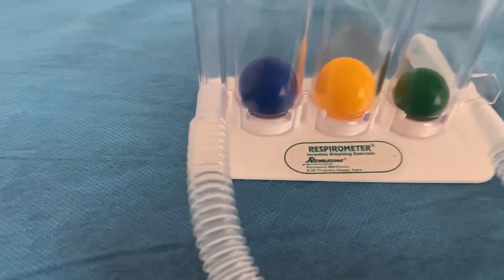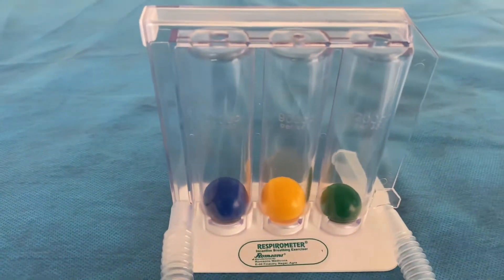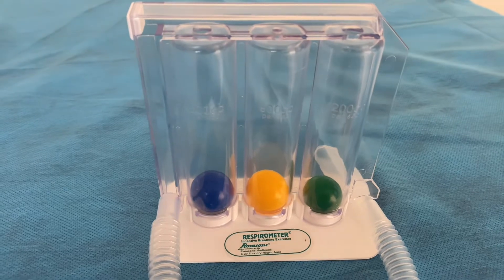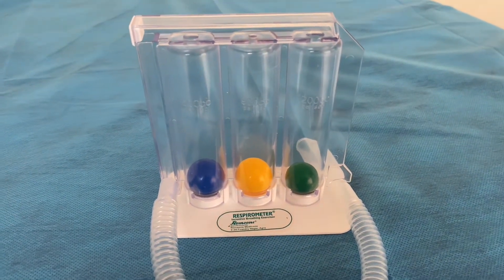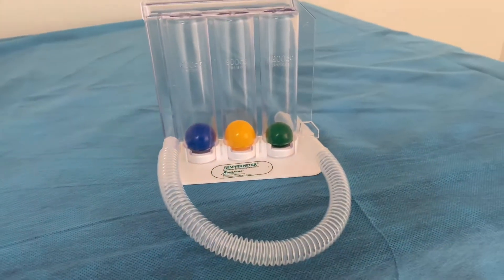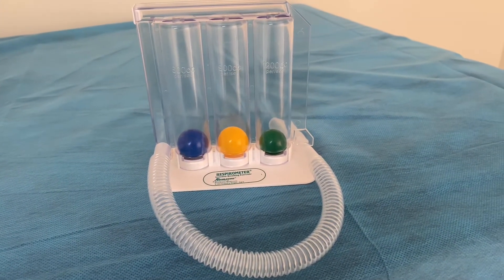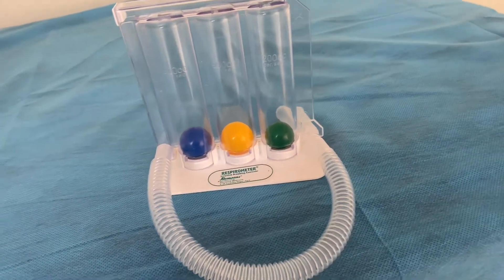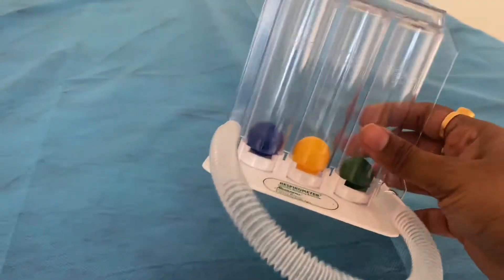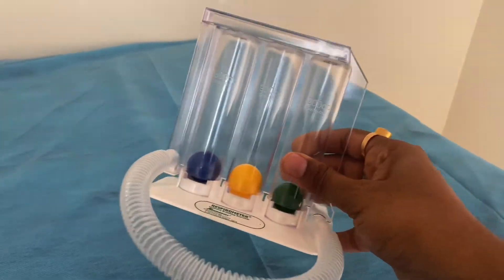This is a respiratory device, very useful for respiratory exercise. I'll tell you how to use it. Just now I recovered from COVID and the doctor has advised me to do the lung exercise with the help of this instrument.